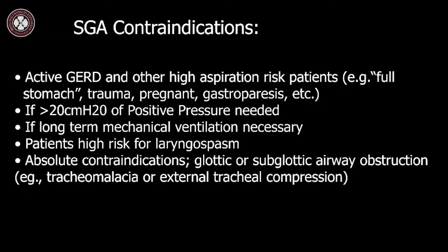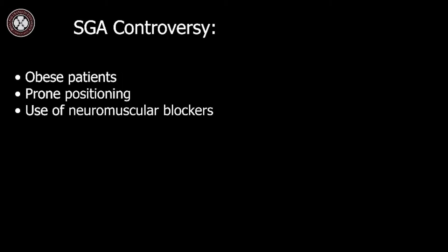Contraindications for SGA use include those with active GERD and other high aspiration risk patients, such as full stomach patients. Also, if positive pressure ventilation requiring greater than 20 centimeters of water will be necessary, and those who will require long-term mechanical ventilation, and in patients who are high risk for laryngospasm. Patients with glottic or subglottic airway obstruction, such as tracheomalacia or external tracheal compression, have an absolute contraindication to SGA use.